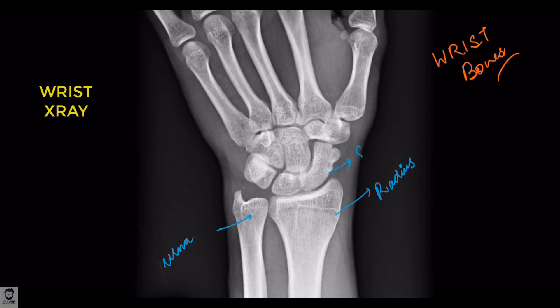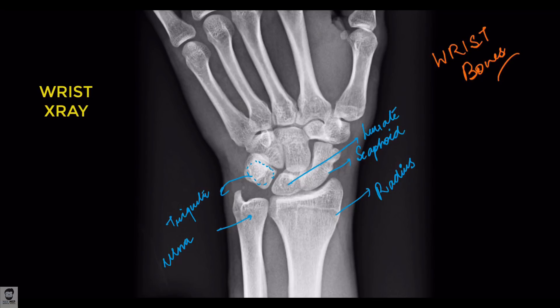Then the proximal row of the carpal bones — the outermost and most lateral — starts with the scaphoid bone. Have a look at our mnemonic videos to learn these bones pretty easily. After the scaphoid is the lunate bone. So we're going from outside to inside, lateral to medial. The next bone is the triquetral.